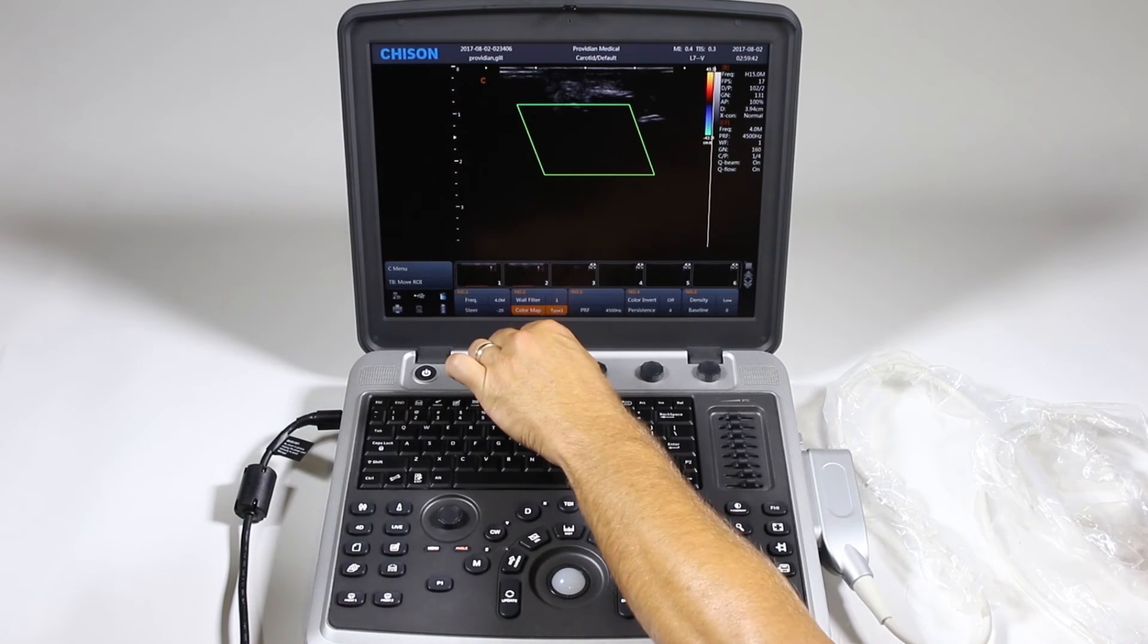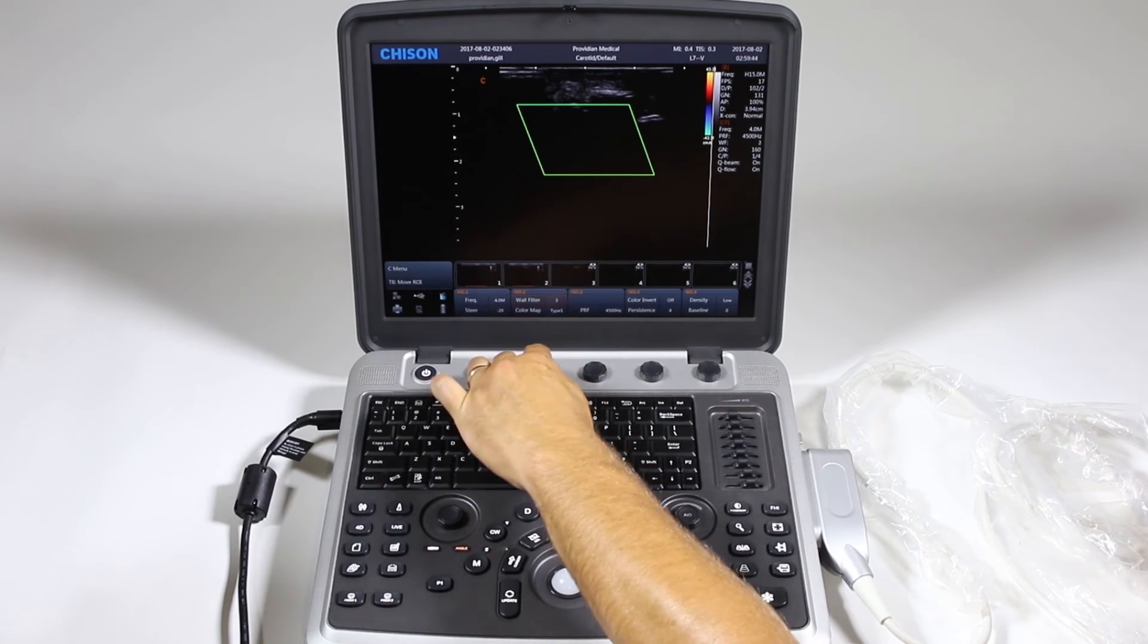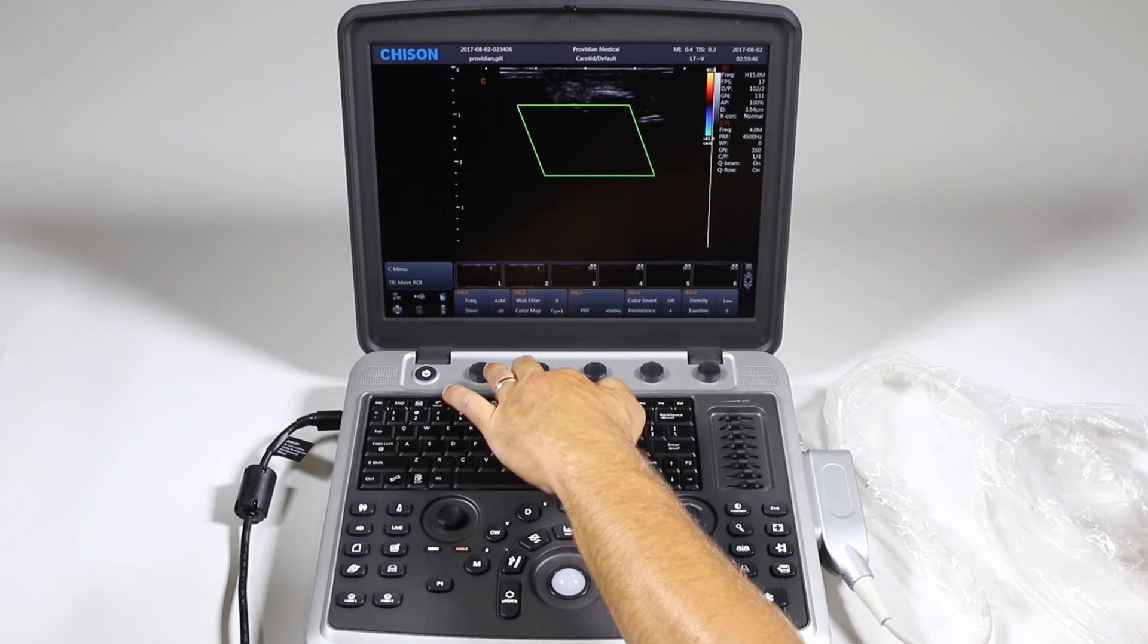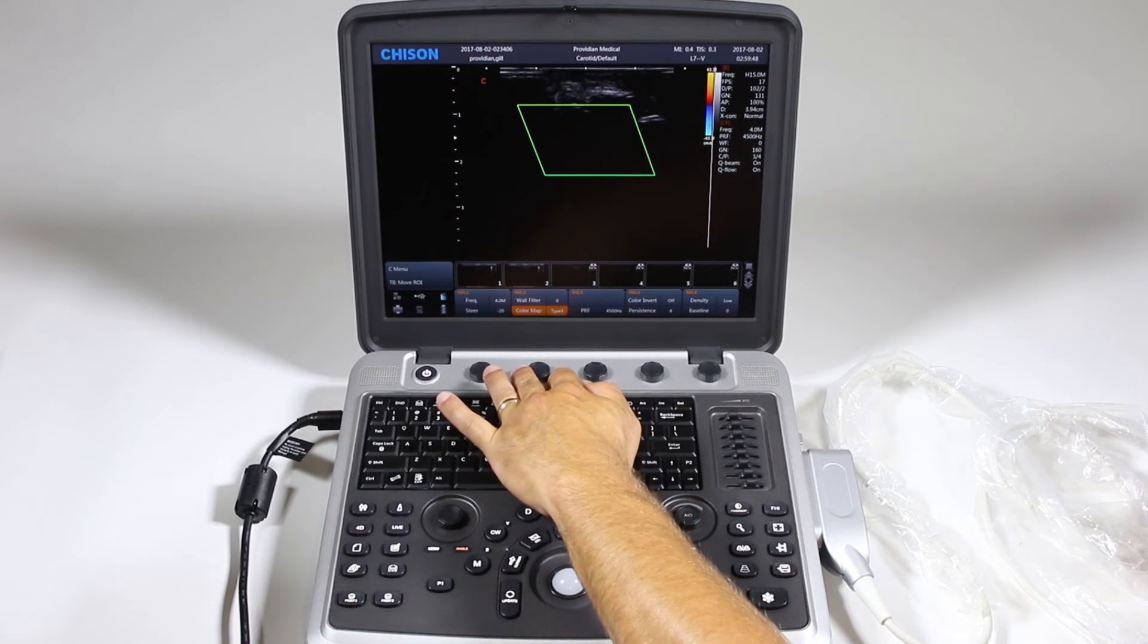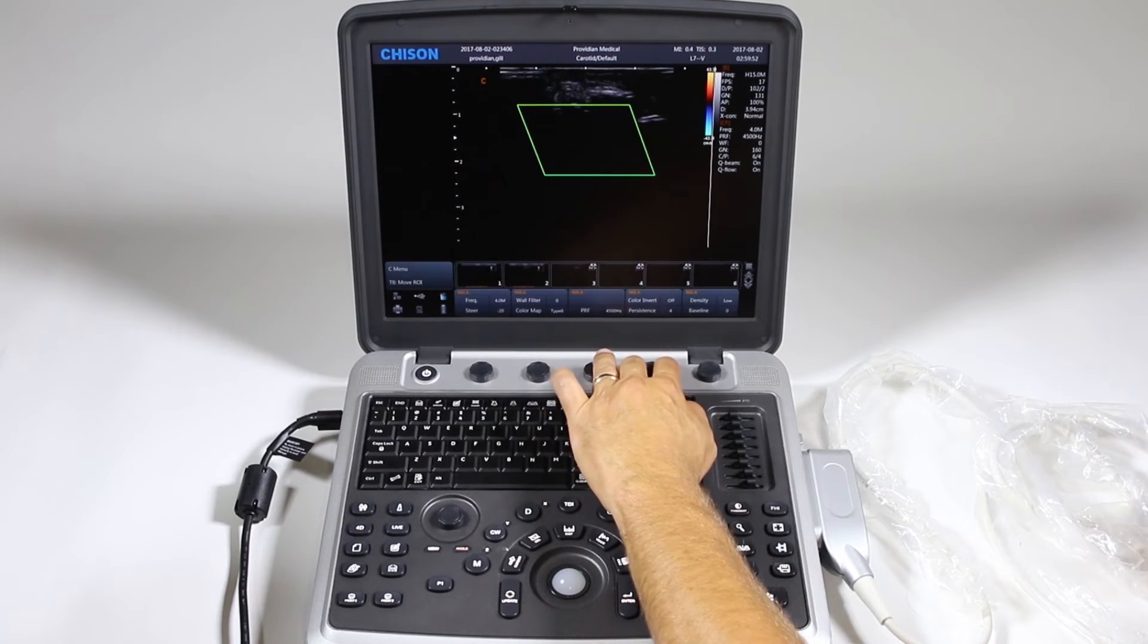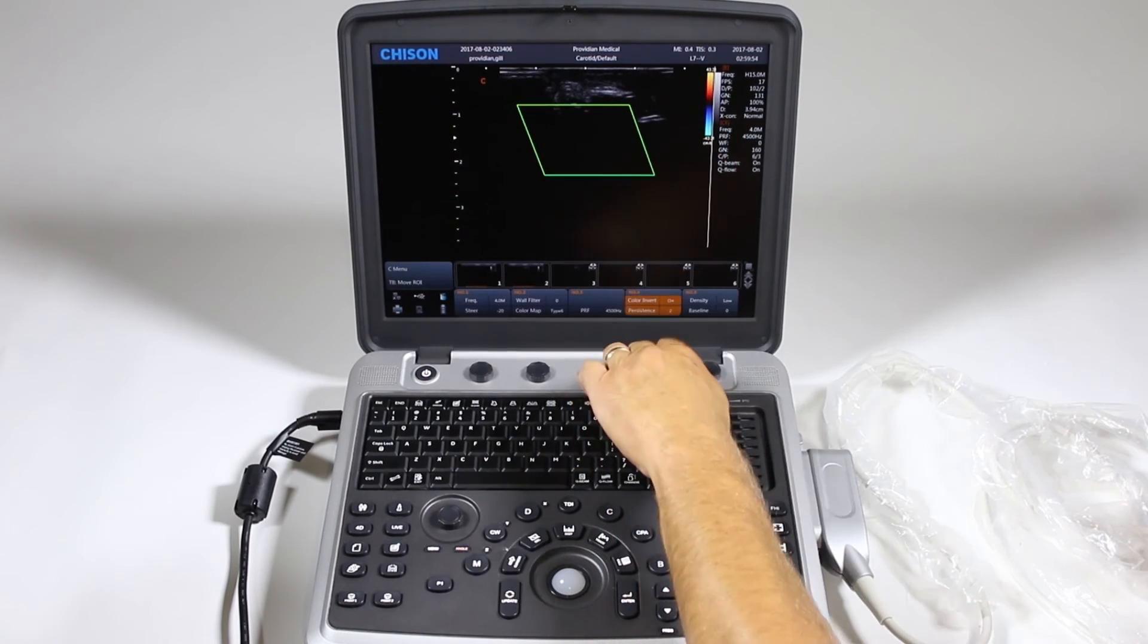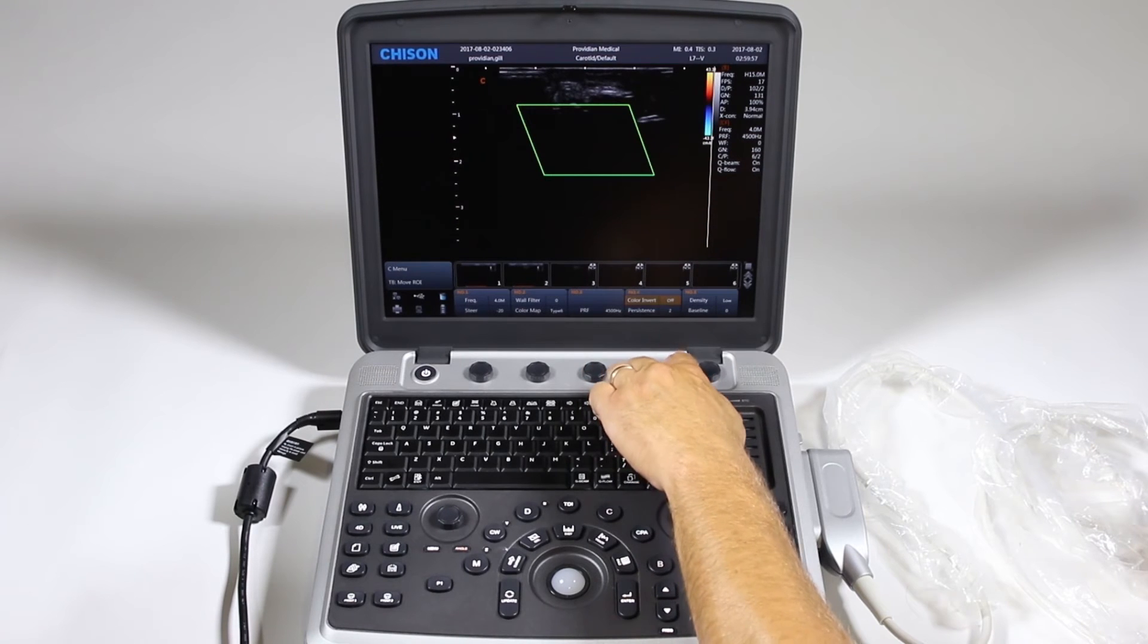Here you have your wall filter. For some reason it's this way for color but not for 2D or regular Doppler. Change your color map, change your pulse repetition frequency, invert the color. Push that and it flips it upside down.